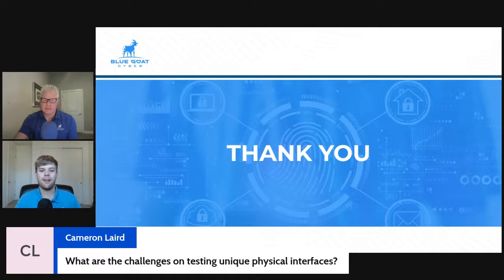Another area that can be challenging is that these require a lot of different physical tools, so making sure that you're well equipped going into a penetration test. All of our testers have crates of different tools and little plugs and cords and cables to try to interact with all these different interfaces. And sometimes you might realize, oh, it turns out I don't have everything I need to test a Bluetooth interface, or it turns out I don't have everything I need to test Wi-Fi. So it's very important to make sure that you have everything on hand, you're prepared for any different interface, and you know what all that equipment needs to be.